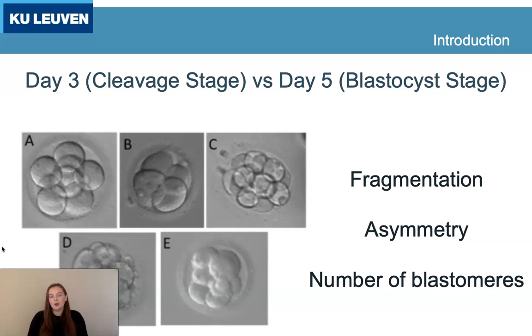Previous studies that automated embryo classification did this with data taken on day 5 of cultivation, which is known as the Blastocyst stage, whereas in clinical practice, embryos are usually transferred to a patient on the 3rd day of cultivation, known as the cleavage stage. And therefore, we wanted to see how well we could automate embryo quality assessments at this stage.